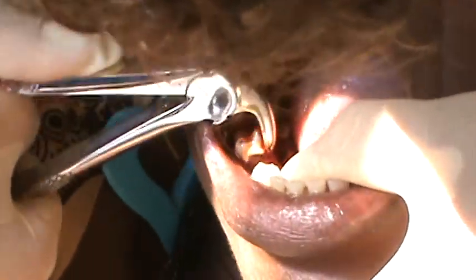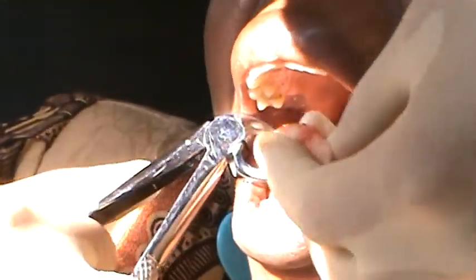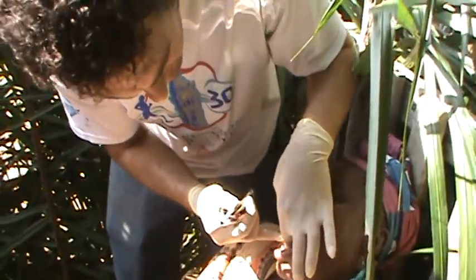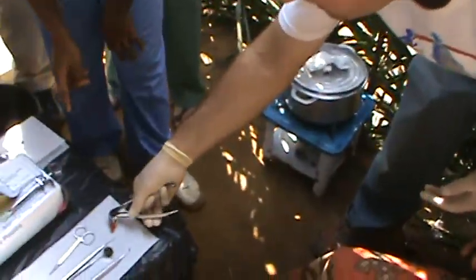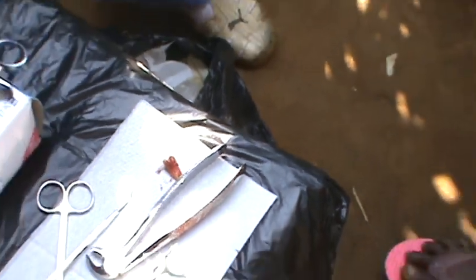Traction — it's not perfect. I need to cut some of the skin off now. The skin? Yes, right there. Film it, film it. When you remove it, the two roots are there — it's okay. Now what you will do: more gauze, you clean the socket. That's pretty cool.